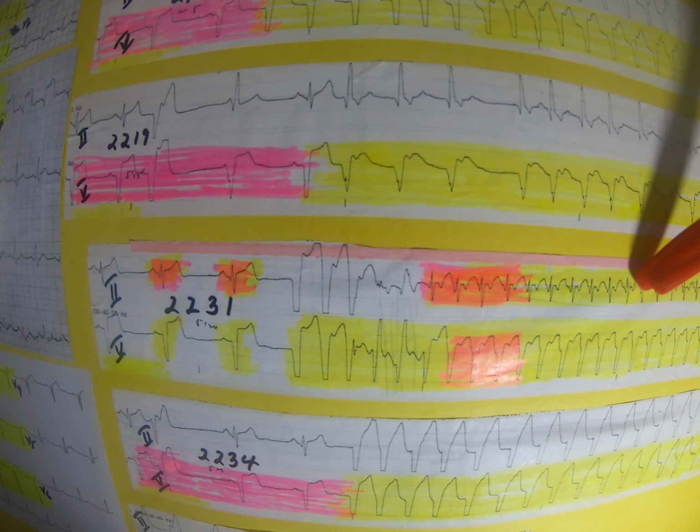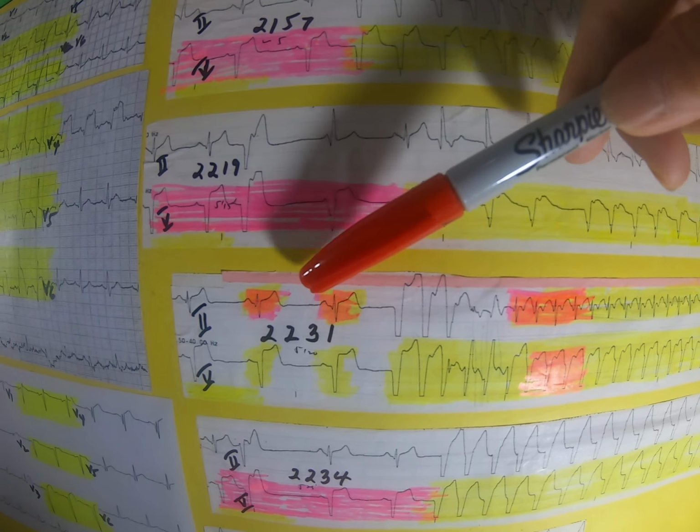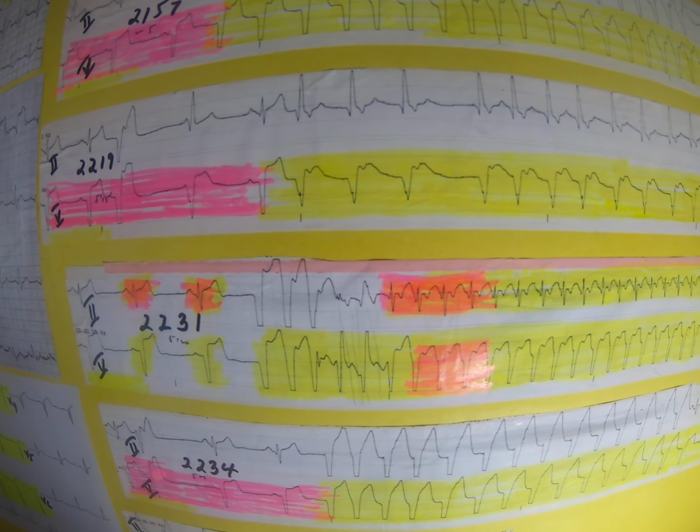But you see this long run in here, which is narrow complexes. If you speed this up, the T and the P wave together, but I couldn't see any P wave. I'll just say this is SVT. Okay, that is one reperfusion that came out. Okay, the patient is tolerating it.